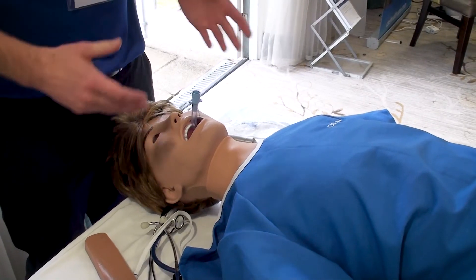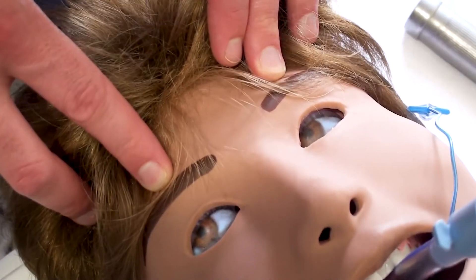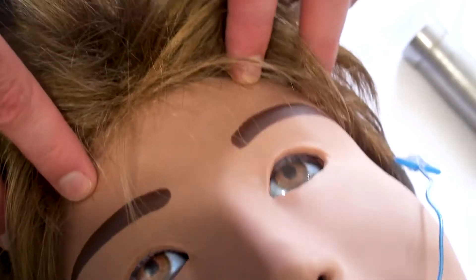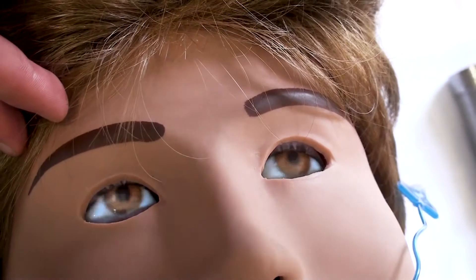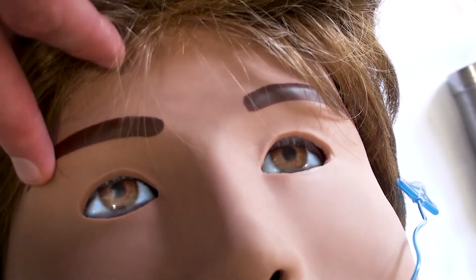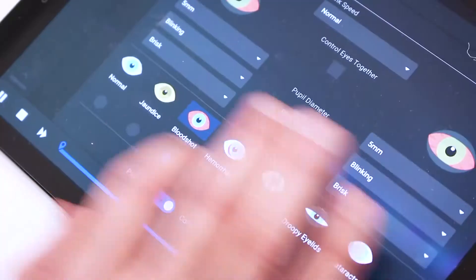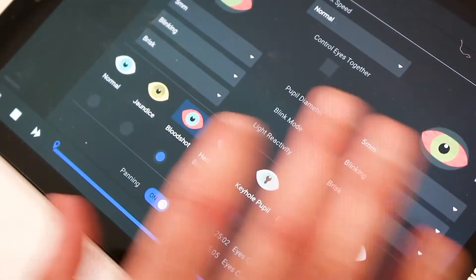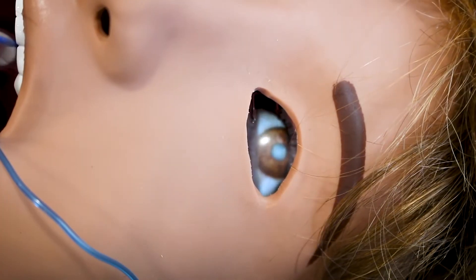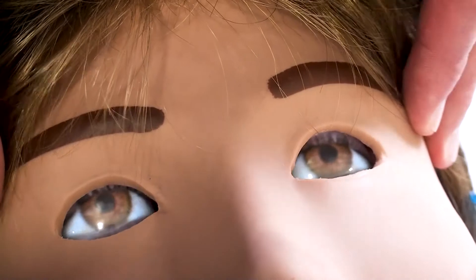She also has a wireless patient monitor. She's got something we refer to as SimEyes — very different to a lot of simulators on the market. They're screens, so you can do all the normal stuff: shut her eyes, open her eyes, responsive pupils, non-responsive pupils, blown pupil. But we can also add conditions such as jaundice, haemorrhage, bloodshot eyes, cataracts, and droopy eyelids. That's pretty unique to CAE ARIES.